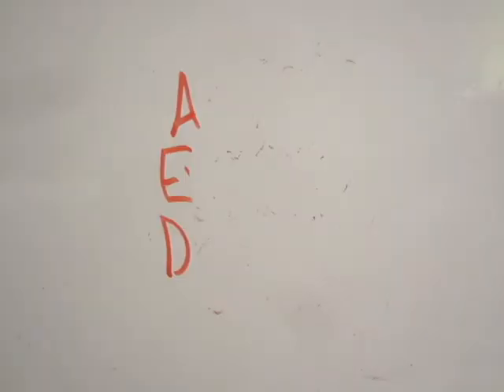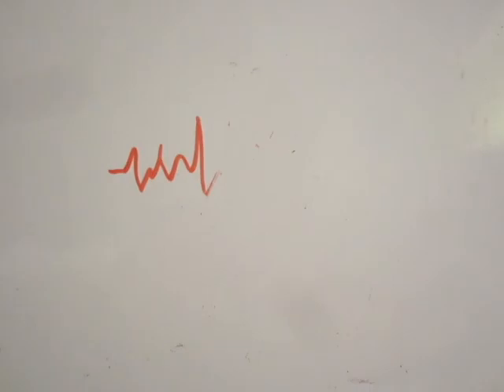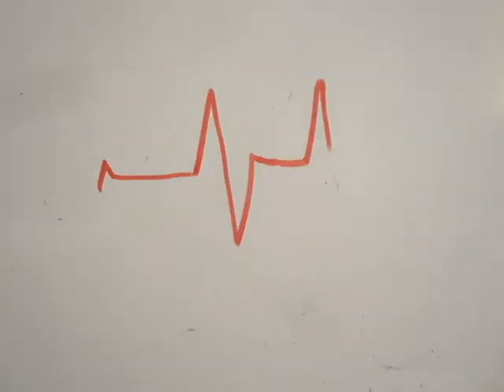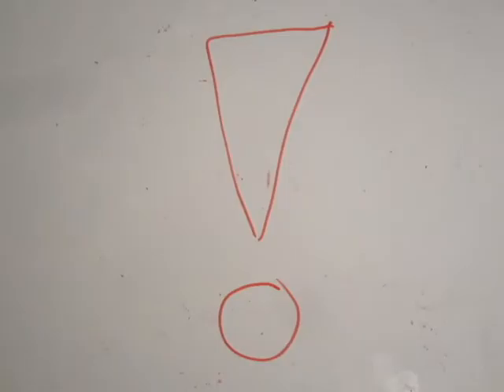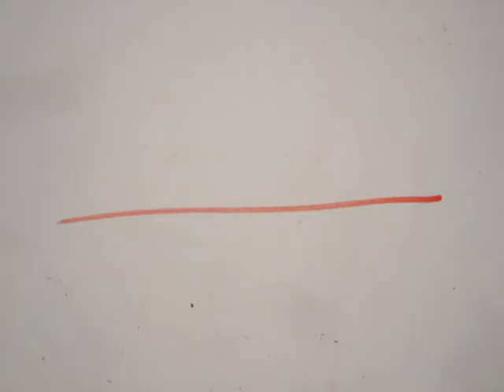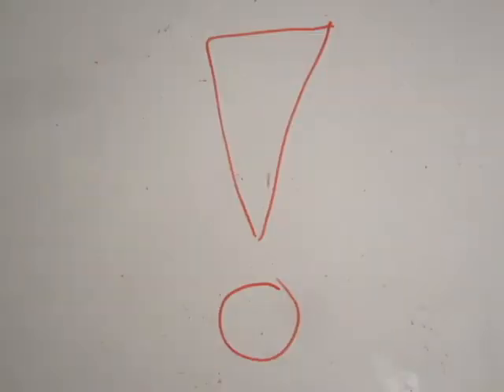An AED, or automatic external defibrillator, is an extremely important piece of equipment that is designed to restore normal rhythm to the heart with an electric shock. In conjunction with CPR, an AED greatly increases the survival rate of cardiac arrest. Make sure only to use an AED where the environment permits. Do a splash test to the ground where the victim is resting, and be sure to get the AED on the victim as soon as possible.